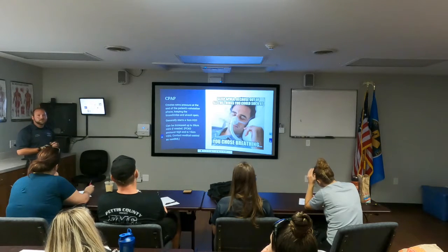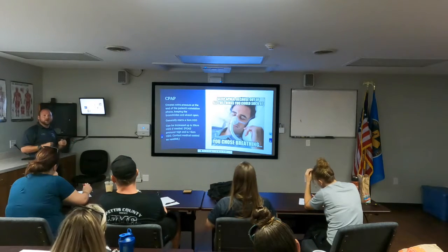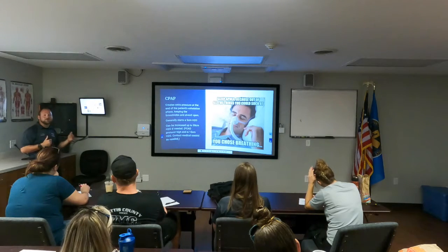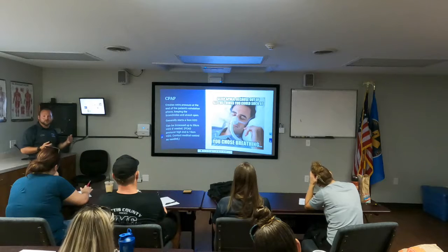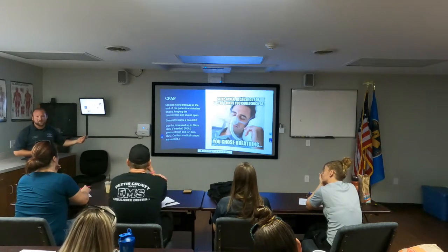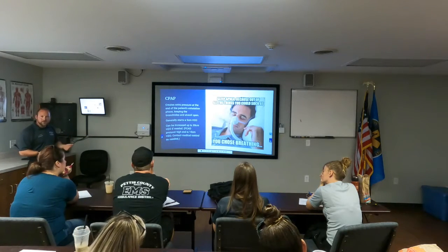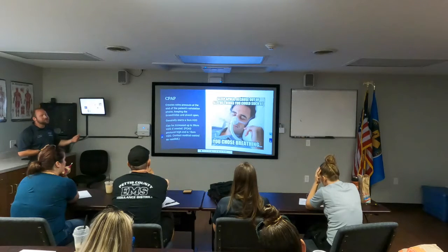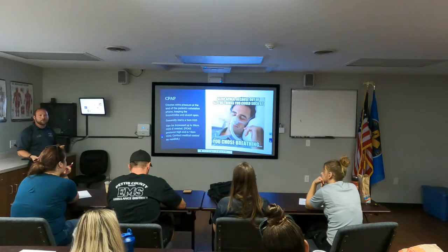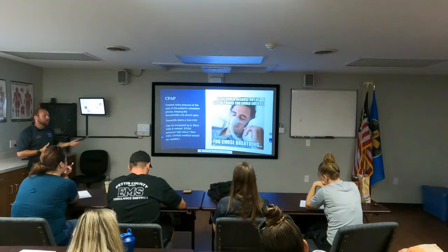Generally where we start is at a PEEP of 5. Physiologically, right now, where is everyone sitting for a normal PEEP? It's about 2 to 3. That is what you normally are at, 2 to 3. So with CPAP, the initial starting point is 5. We can go all the way up to 30 on some ventilators. For us, protocol says 15. Anything higher than that, we need to contact medical control or consult with the physician on that transfer if we're taking them out of bottle.